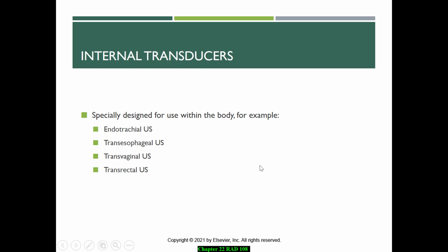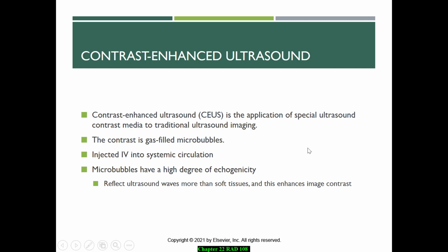And then you do have internal transducers that can be done with ultrasound. And these are especially used during early pregnancies. So if they're within the first 3 months, or within the first few weeks, they may do a transducer. So it's called a transvaginal ultrasound that's being done in that situation. Ultrasound can have contrast enhanced, and that contrast is injected through the IV, and I think that's kind of surprising to some students, that they don't realize that ultrasound does have some contrast exams that are done.